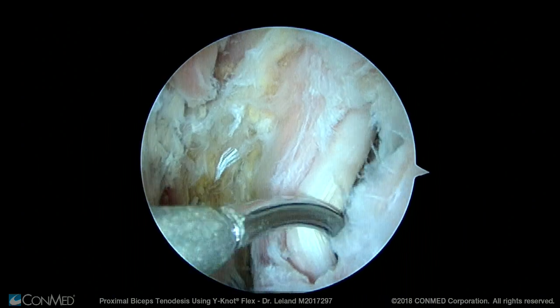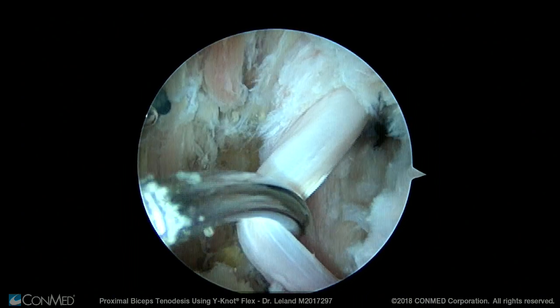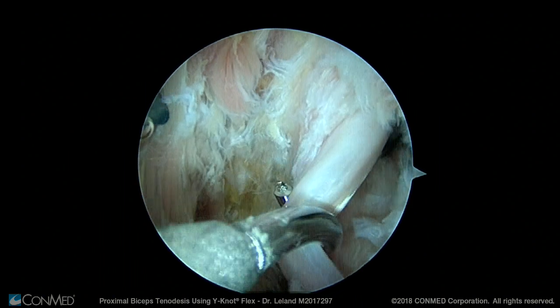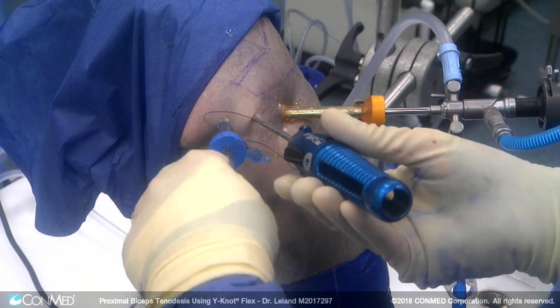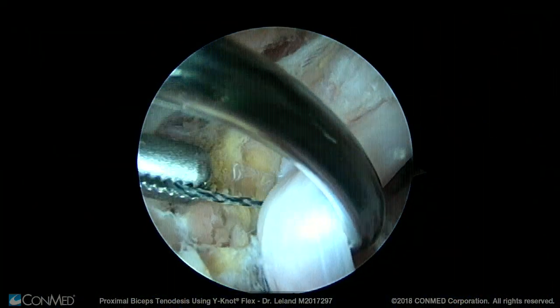We take a Spectrum 2 and pass it around the biceps tendon, keeping in mind that the biceps tendon is still attached at approximately this point in time. We feed suture around the biceps tendon and pull it out through the anterior portal.